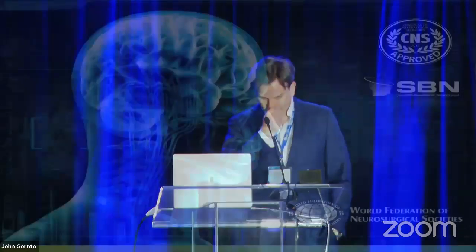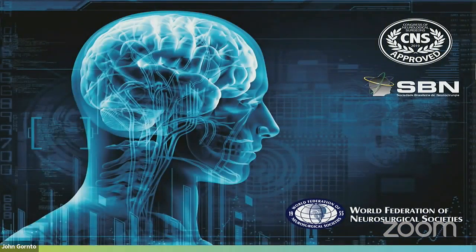So before Jens answers that, going back to your blood volume, this is our early experience, and we discussed this before. Blood volume in our early CTP experience seems to be a better predictor than blood flow. But on RAPID, we use blood flow. So is there any way that we could add that blood volume? Because again, if you see a black hole in the blood volume, you know the brain is dead. Yeah, so there are blood volume maps that come out automatically. The CBF comes out first.